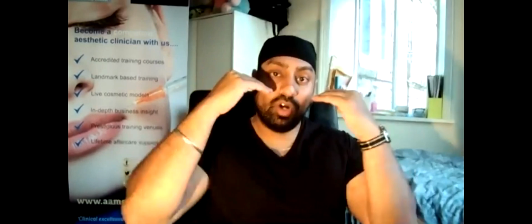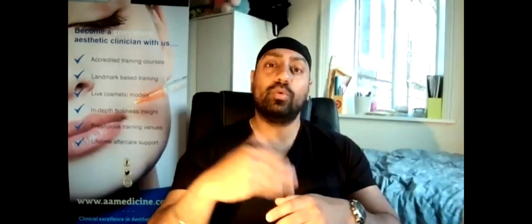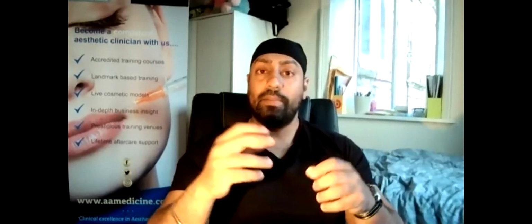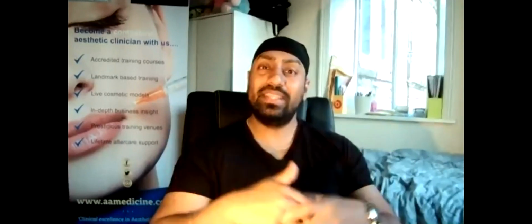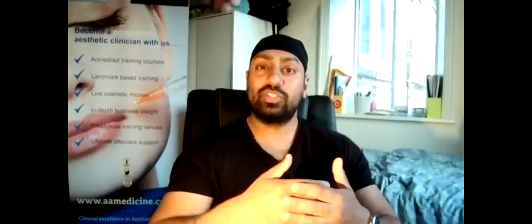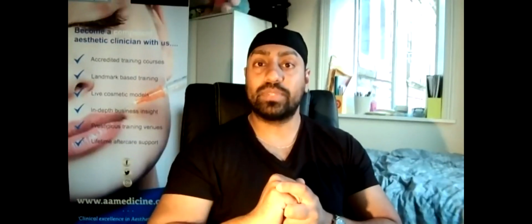But if they have a true hollow, sometimes it gives the appearance of having dark circles. So always try to lift the hollows out first and then work on the more superficial layer. Sometimes another little trick is to get the filler and blend this even with a very small amount of Botox, and get a cannula and then feed this through in the superficial layer, and that will help soften any fine lines and wrinkles without causing ectropion.